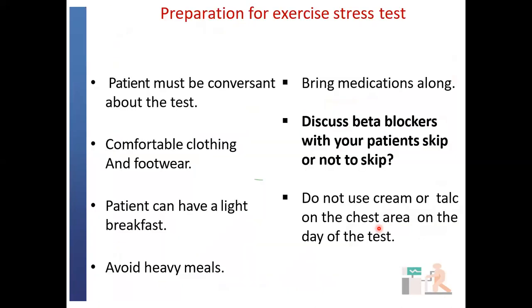So let's take a brief look at patient preparation. One, you must explain the test to the patient vividly and you must be conversant with the test. Sometimes it might even be useful to give a patient a little demonstration on how to go about the treadmill, because that will improve the safety and outcome of the test. Patients should be advised to come in comfortable clothing and footwear. They can have a light breakfast. They should avoid heavy meals. Mostly, it's advisable that the last meal before the test be not less than 3 hours before, because putting patients on a treadmill on a full stomach might trigger some discomfort and sometimes lead to vomiting.